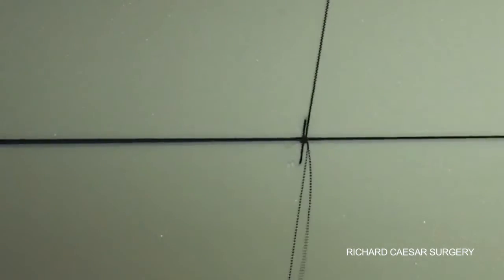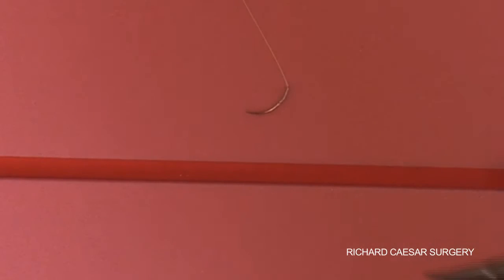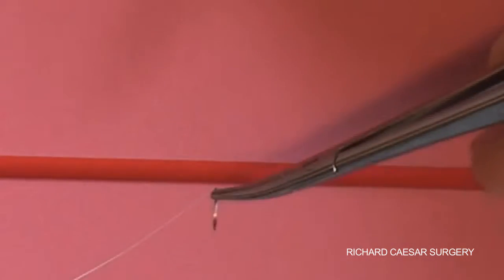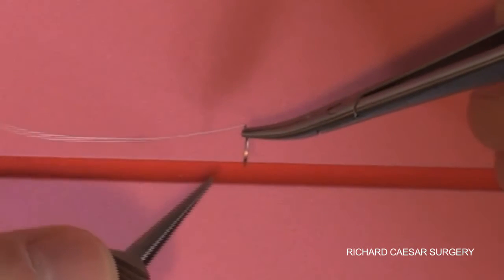The sutures and suturing techniques really need to be fully understood before you come to a patient. The aim is to hold the suture at the two-thirds, one-third point, where you have the most control as you're on the flat.